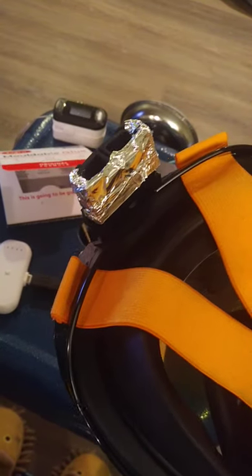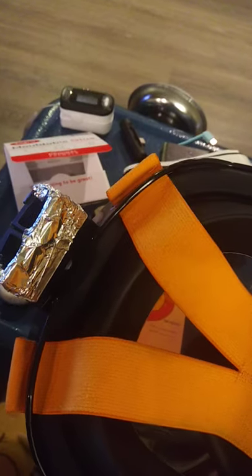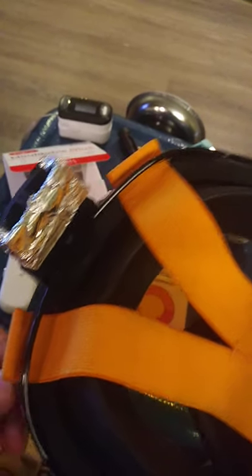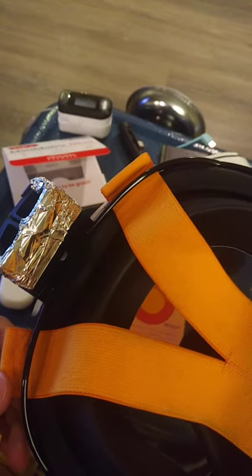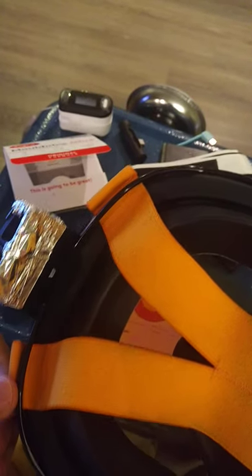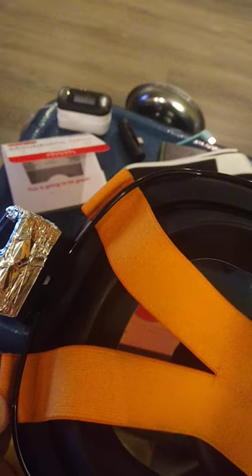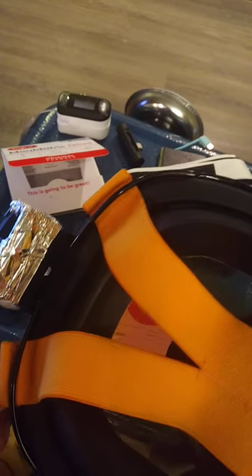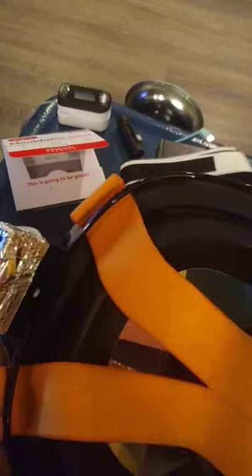With all that said, I present to you the Infinite N95 version 3.0. Like the competitors I mentioned and as in the previous video, we're actually going to be using the power of UV ultraviolet light to help sterilize the air we breathe.